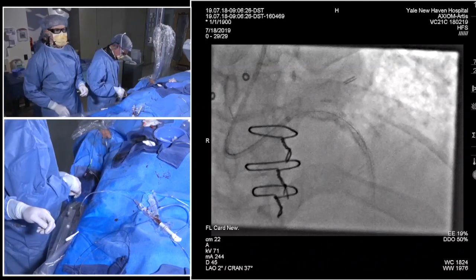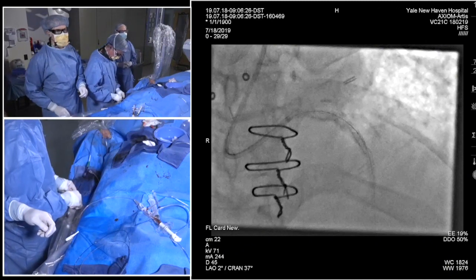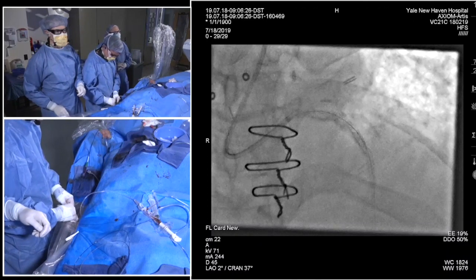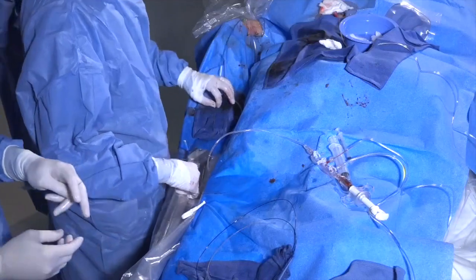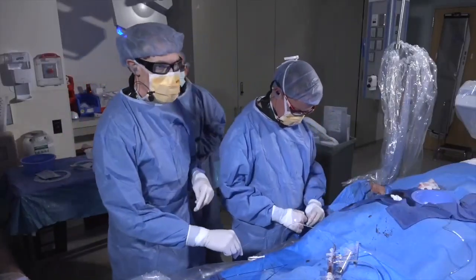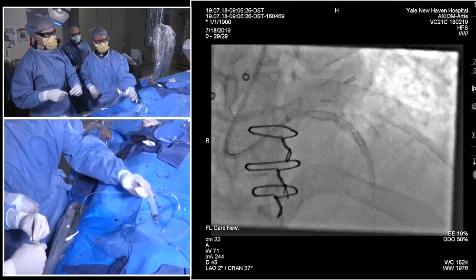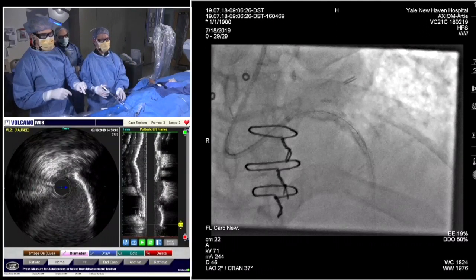We couldn't quite reach the ostium with the 38. But by the IVUS, the ostium didn't look that bad. It's totally up to you. We just looked at it cursorily, but you can IVUS it. You're going to IVUS it anyway at the end, so you can take a look. I don't know if you can switch over to the IVUS. You want to put the IVUS up live? Is that possible? Yeah, there you go.